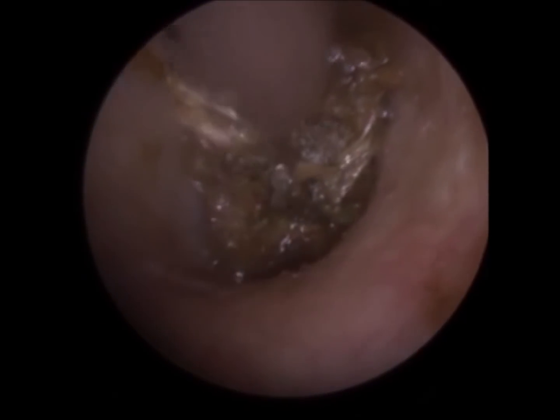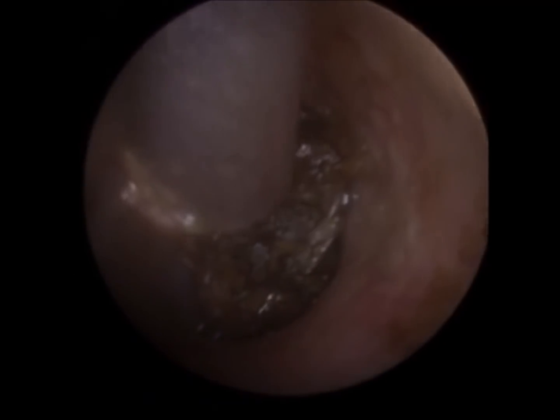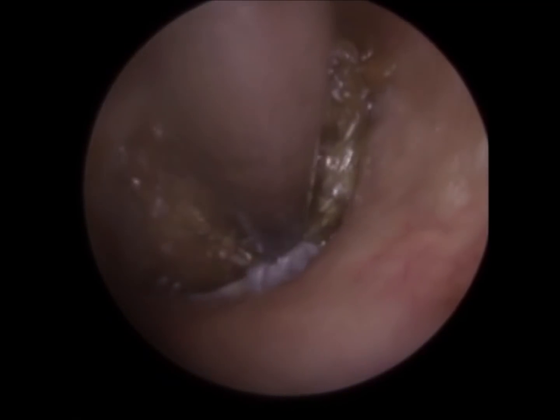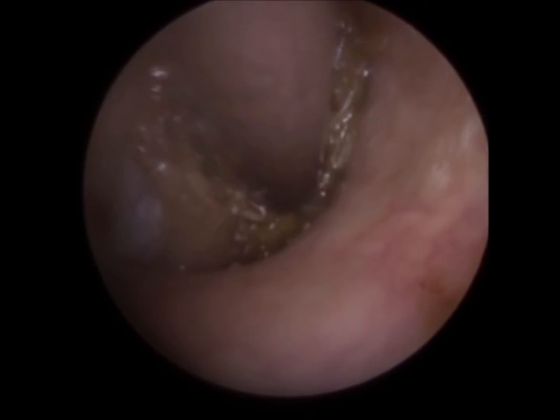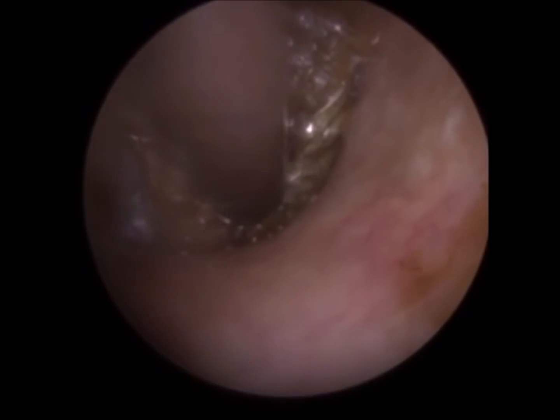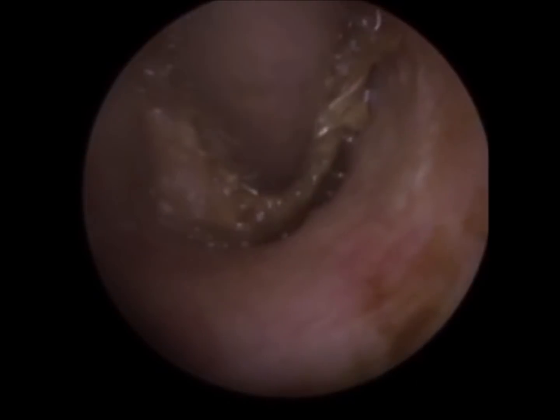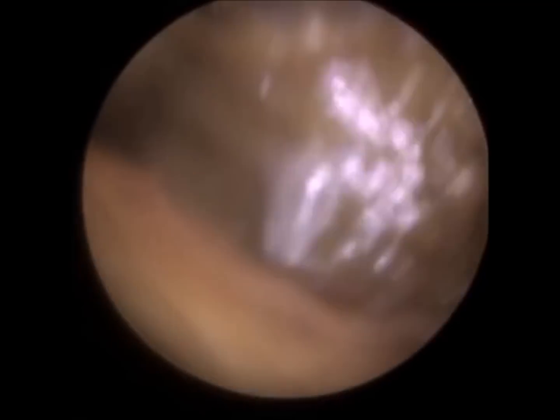A fine end wouldn't be strong enough for this. Suction probe just got blocked, so I just came out. Yeah, fine end wouldn't be powerful enough for this, and because the wax is still a bit sticky, the fine end, the tip, the diameter is a lot narrower, so it's much easier to get blocked. So for this, I had no real option but to use a suction probe. Couldn't use a hook, couldn't use forceps, couldn't use a Jobson Horne, because you had to get in and behind the wax, and it would just have been very uncomfortable.